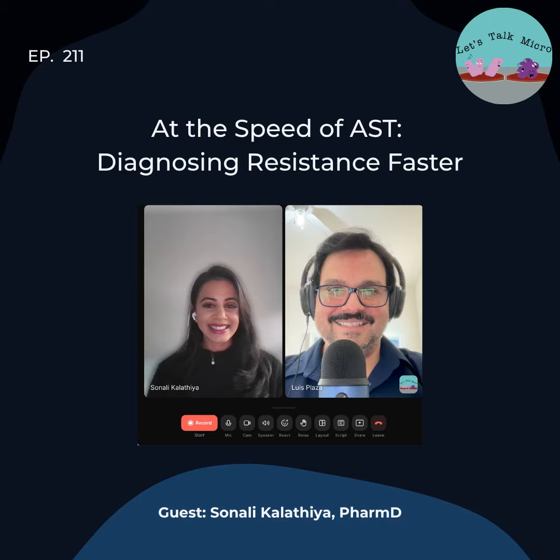Yeah, so you touched on the workflow related challenges. I think in addition to staffing and training and hours and all of that, and the clinical response, what method will be used for identification? If we're hoping to really optimize our time to results, then it really benefits the whole workflow to have a rapid identification method as well. So what is the method of identification that will be utilized with the FAST AST? Because we know that information is needed prior to reporting the AST results.